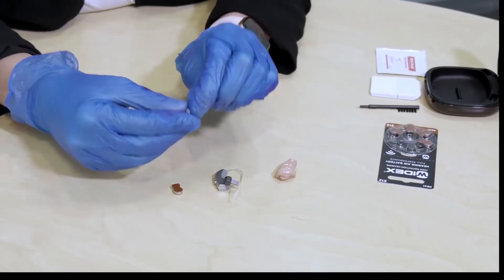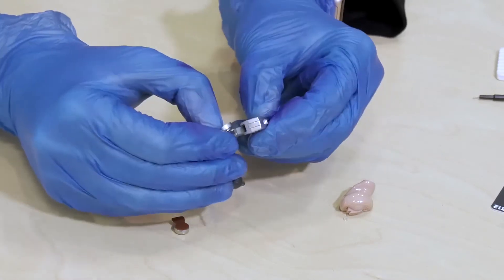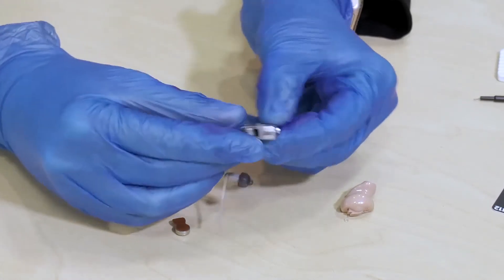Now you want to take the sticker off the battery, open up the battery door and just check that it wasn't just the battery that had run out.